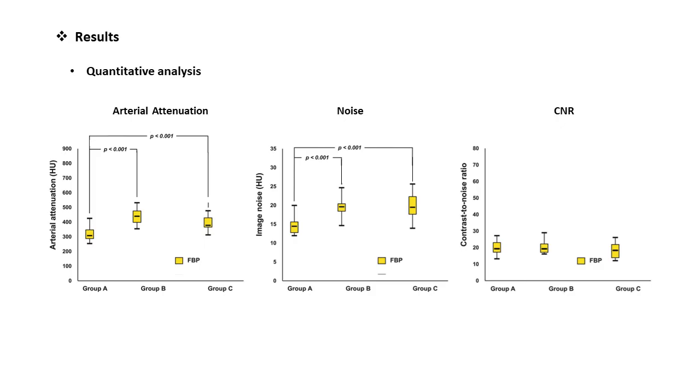Now let's look at the quantitative analysis. First, the yellow bars in the graph represent images processed with filtered back projection.